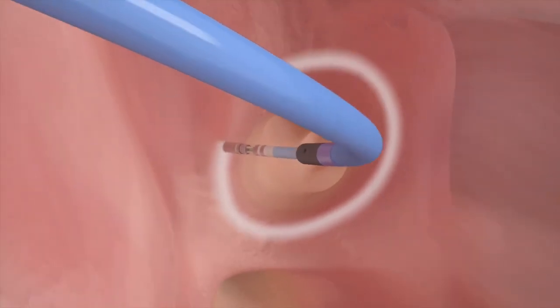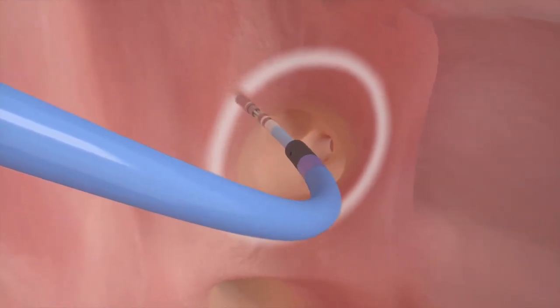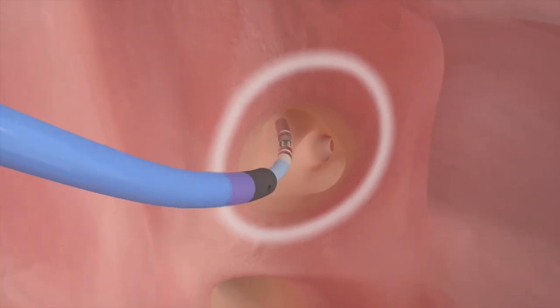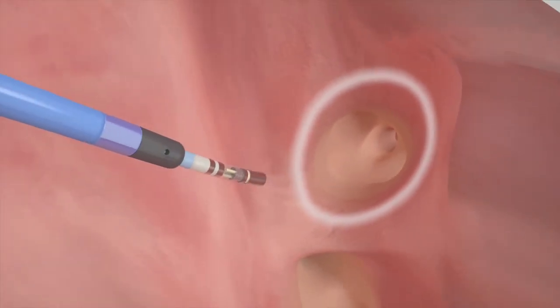The lesions that are created work to isolate and prevent the abnormal electrical signals originating from those pulmonary veins from reaching the rest of the heart.